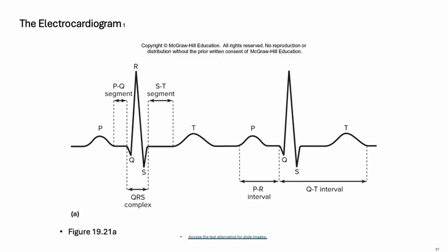So for each of these, one thing I would recommend you do to learn this is to practice drawing a normal EKG waveform.